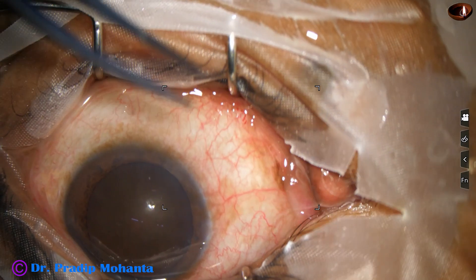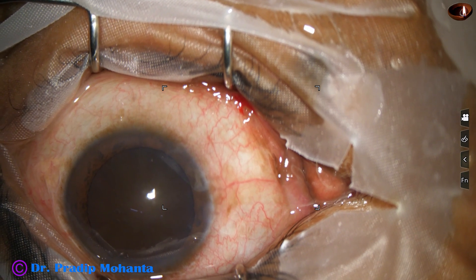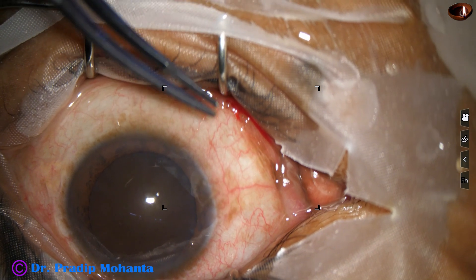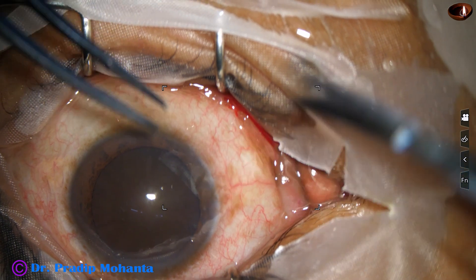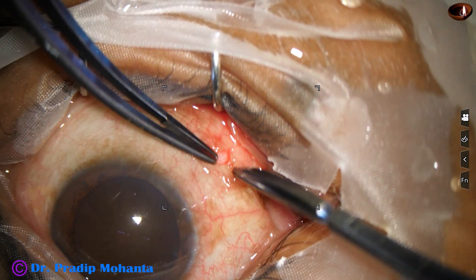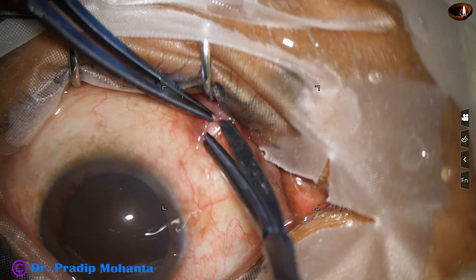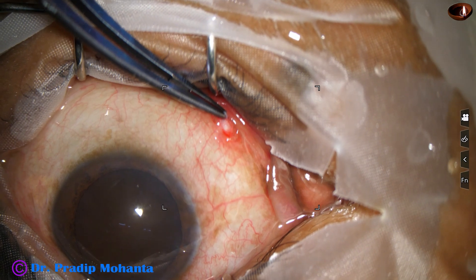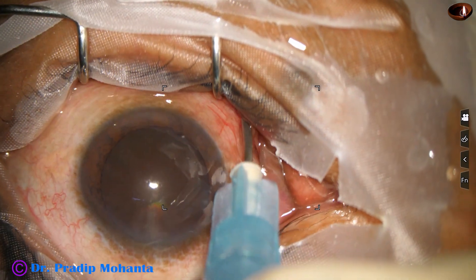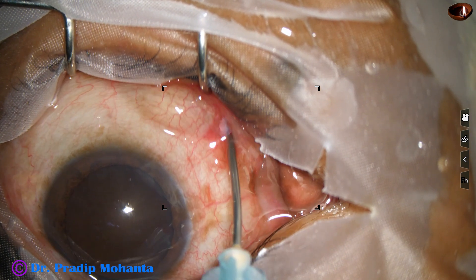In such cases, this is what we can do. After applying drops, I am enhancing the anesthesia by subtenon block. Subtenon block is for the surgeon and topical is for the patient. In such hard grade 5 nucleus, it is better to get enhanced anesthesia by subtenon block. It should not depend on topical anesthesia alone in such cases. This is my personal opinion.